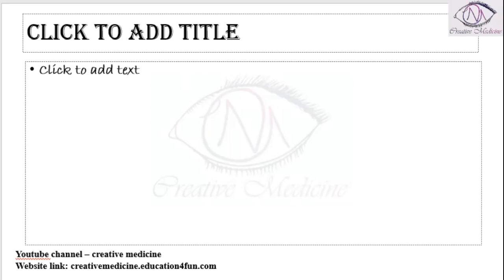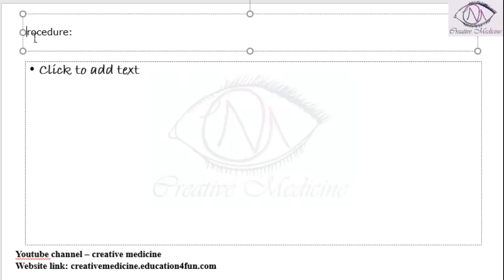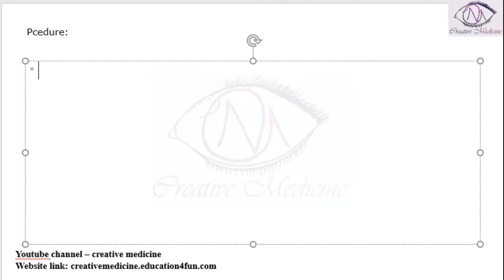So if you see the procedure of fundal fluorescein angiography, we actually give the patient 5 ml of 10% fluorescein, injected into the antecubital vein. So 5 to 10 ml, 5 ml of 10% fluorescein, which is a fluorescent substance, that is a substance which gives light. So fluorescein is injected into the antecubital vein.